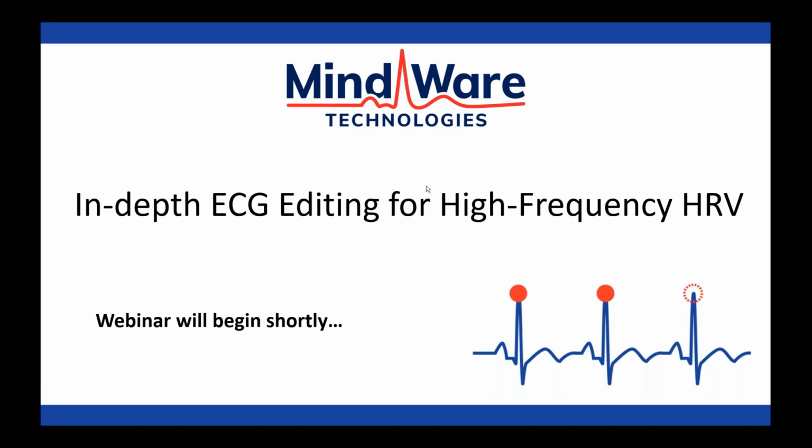We're going to be getting in depth on editing ECG for high frequency heart rate variability.